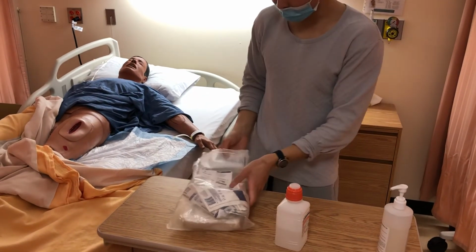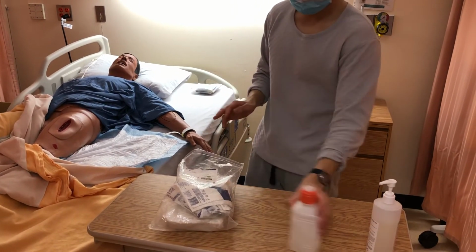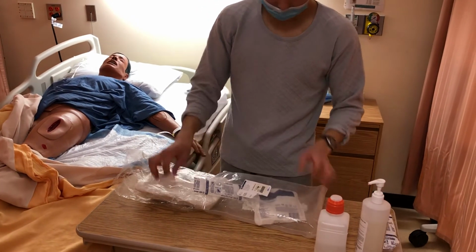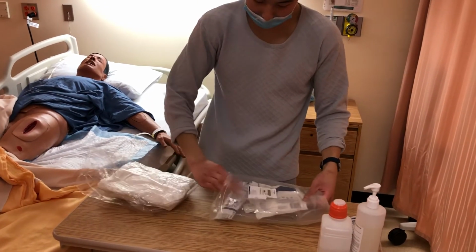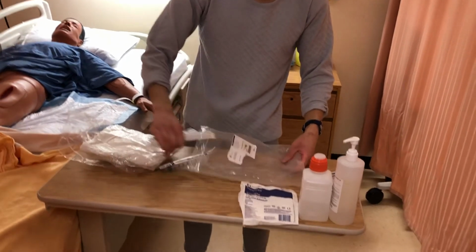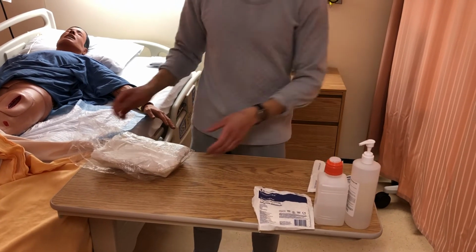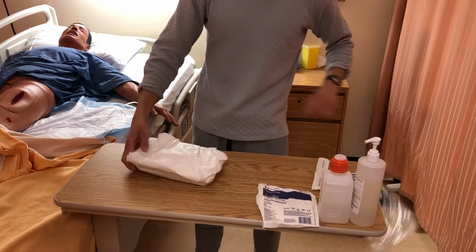Now I'm going to get everything I need. First I have my sterile gloves, and now I'm going to get everything in my wound care kit. I have my syringe, my medical tape, as well as my abdominal pad, and my Cathlon and my cotton sticks. Lastly, I have my actual wound care kit, which is fully intact with no damages.